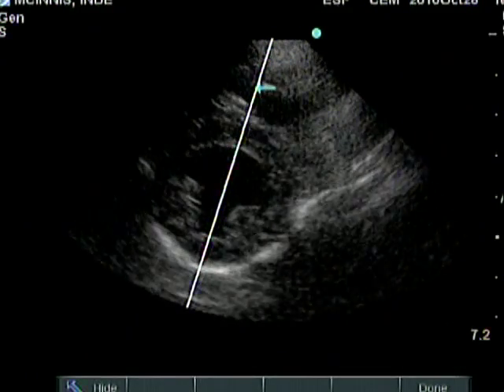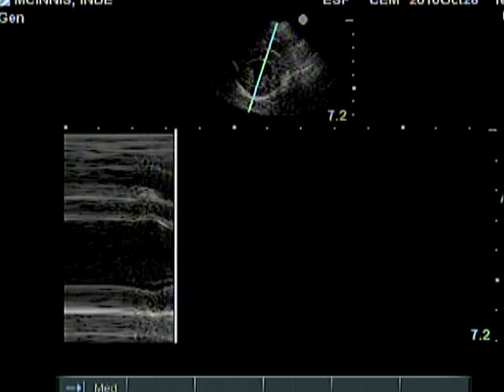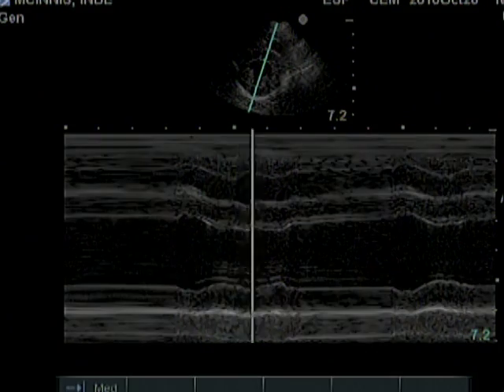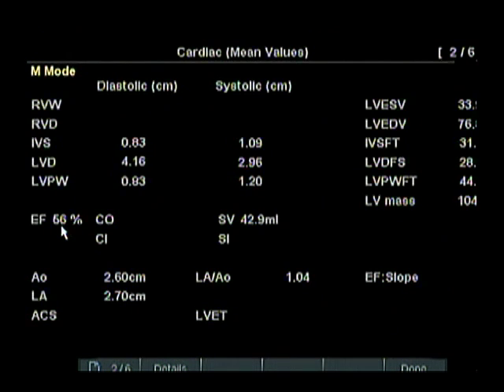I teach you how to use M-Mode to measure the heart's chamber sizes and muscle thickness. I help you to document your findings and understand the interpretation of those measurements.